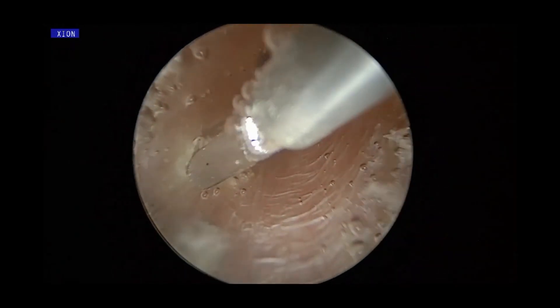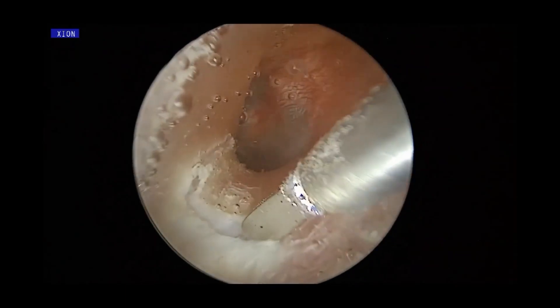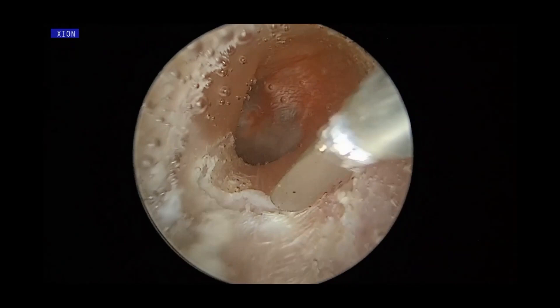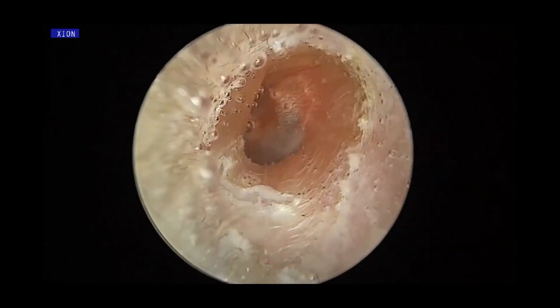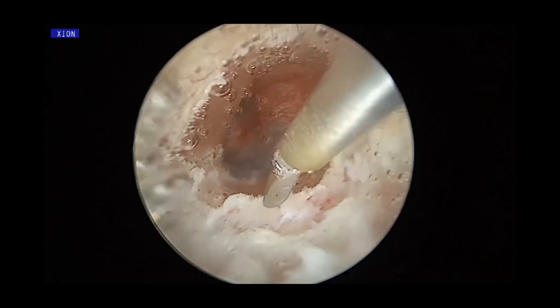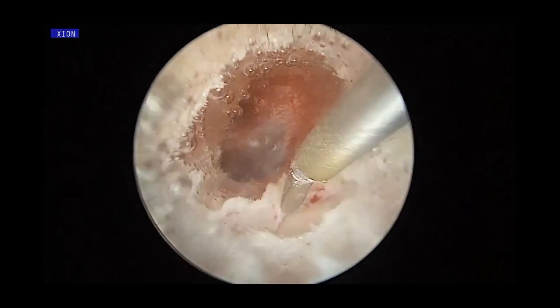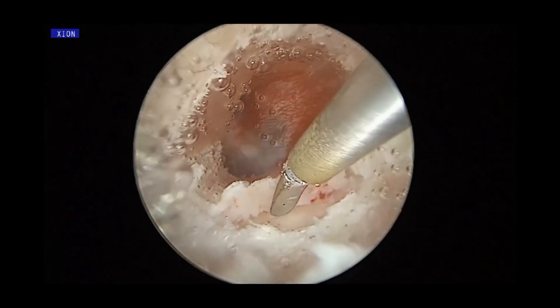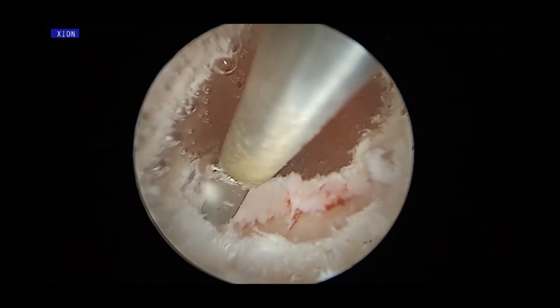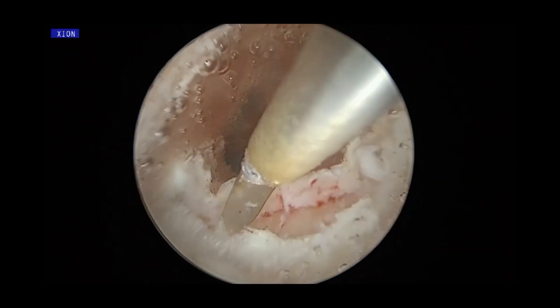We performed the operation under the auto-view system. This is a plasma electrode-like elevator. In the initial stage, for safety considerations, we use the coblation mode of the electrode. There are some flap retractions.